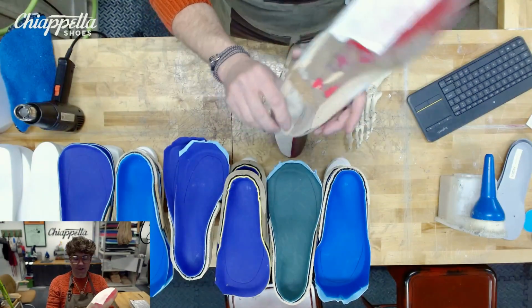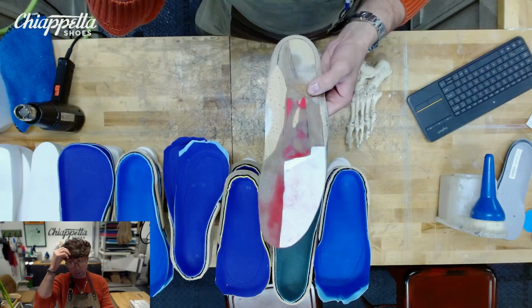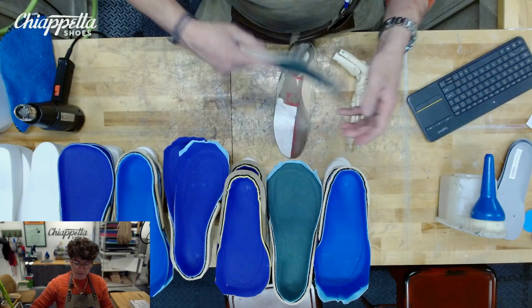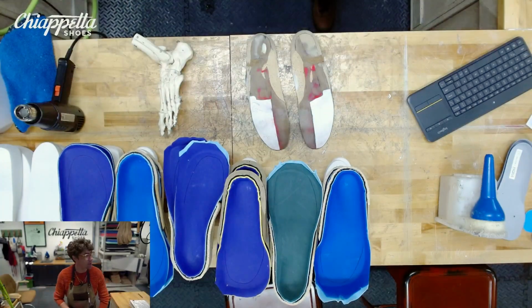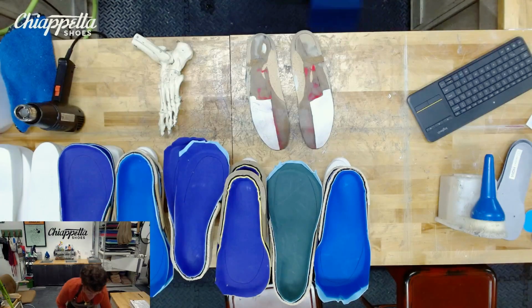The other thing I'm going to do is on the heel, I'm going to add a 1/4 inch of Poron. It's going to give a really nice cushion to it. So, considering the foot and all the situations that we're dealing with, we're kind of going away from corrective. We're going much more accommodative with this situation. So we get 45 here.